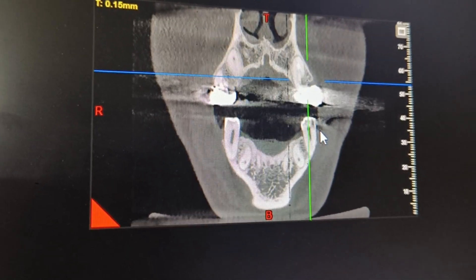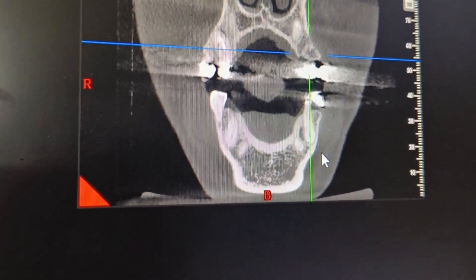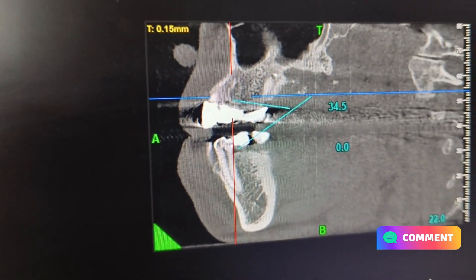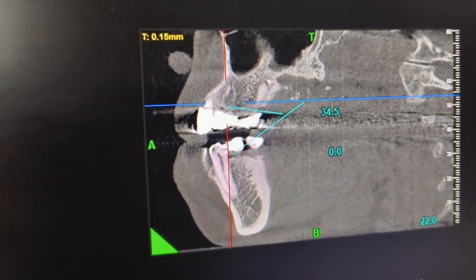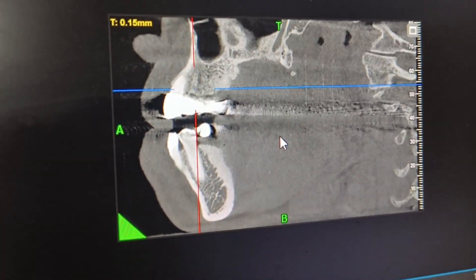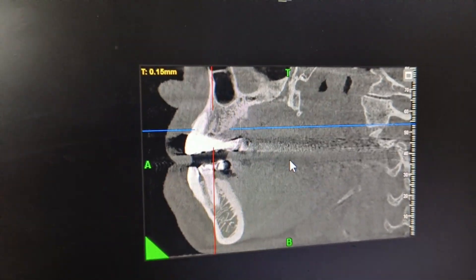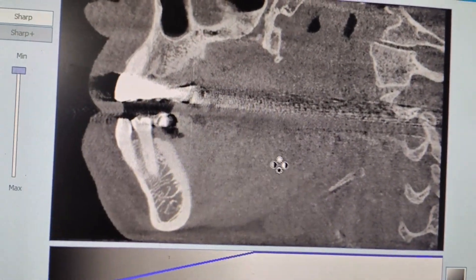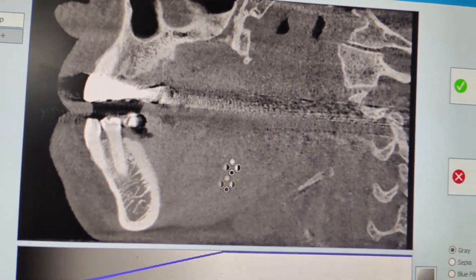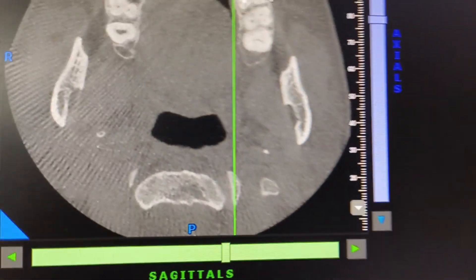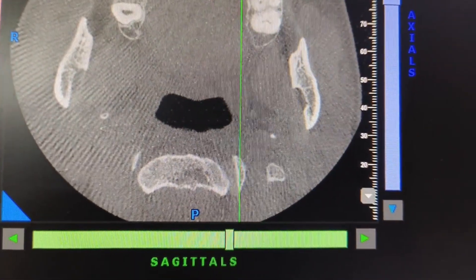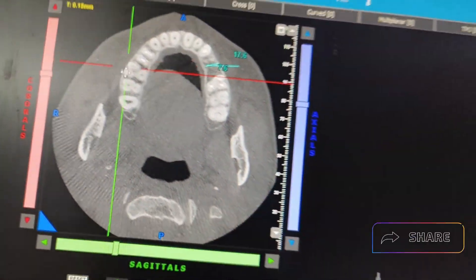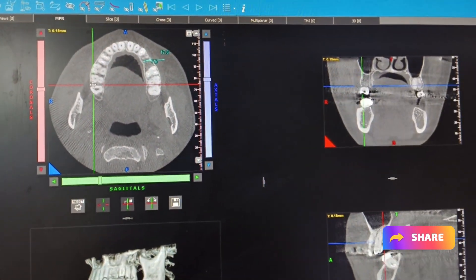You can see the tooth mesially and distally, and this is the transverse section. You can expand it and see that a lot of bone is there for implant placement. You can move the cursor and along with that, you can see all the planes are moving together.